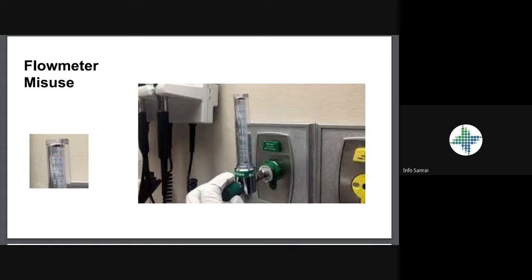There is a secondary problem, which is that as we increase this flow rate, we're increasing the flow of air through the sieve beds, and these higher flow rates of air going through the sieve beds create an accumulation of moisture in the zeolite, which can also substantially reduce the life of the sieve beds. Our experience in hospitals in Malawi is that clinical staff believe that higher flow rates are better for patients, and we frequently come across concentrators where the knob is fully open.